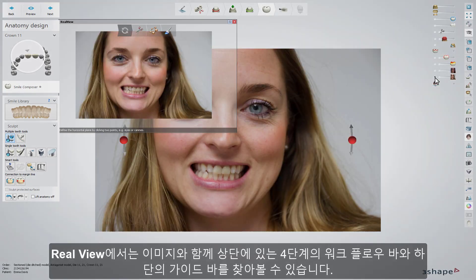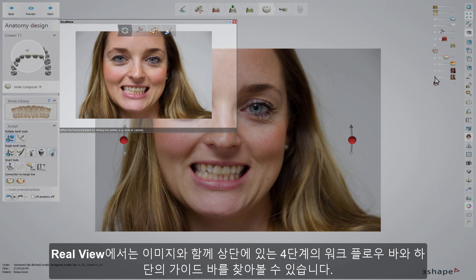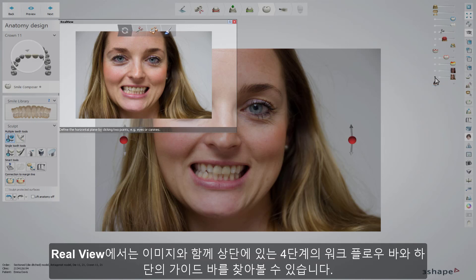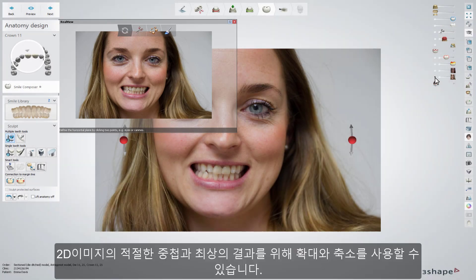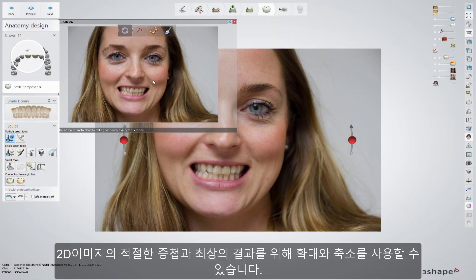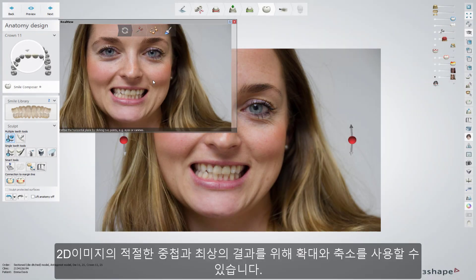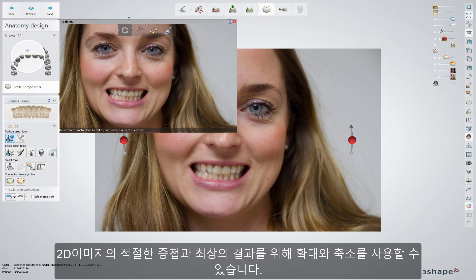The RealView window that appears with a picture contains a four-step workflow bar situated at the top and a guidelines bar situated at the bottom. To properly overlay a 2D picture, zoom and pan it for the best result.